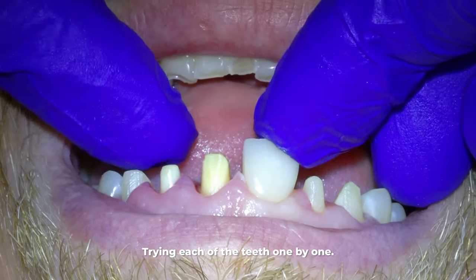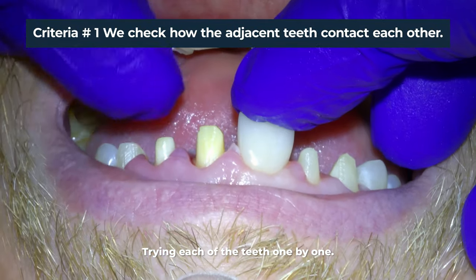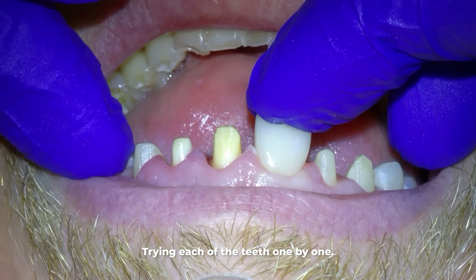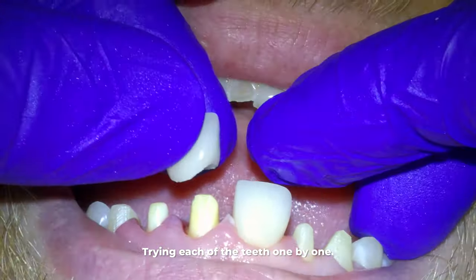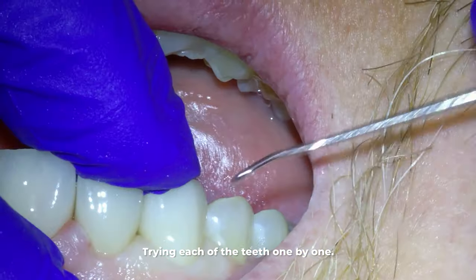We are checking five main criteria. First, we check how the adjacent teeth contact each other — you don't want it to be too tight or you can't floss between them, and you don't want it to be too light or they will get a lot of food caught between the teeth.